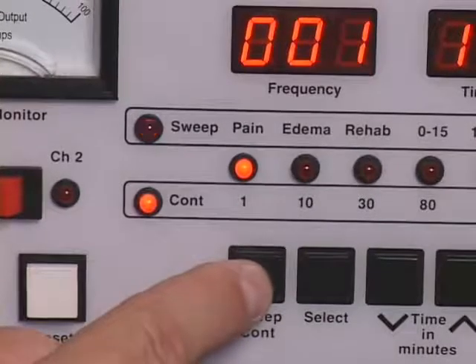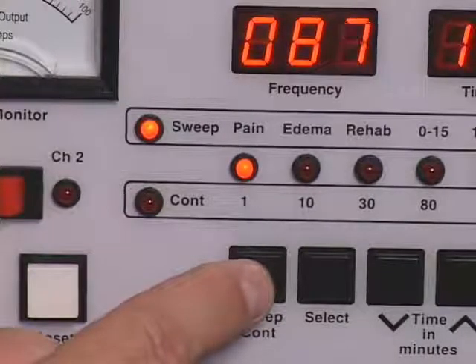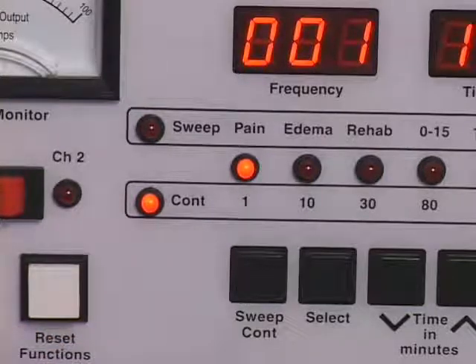Press the constant sweep control to select constant mode or sweep mode. The constant or sweep mode indicator light will illuminate. The constant sweep control selection can be changed any time during treatment. To avoid possible patient discomfort, reduce the intensity controls to the zero reset positions, enabling the audible clicks before changing the constant sweep control selection.